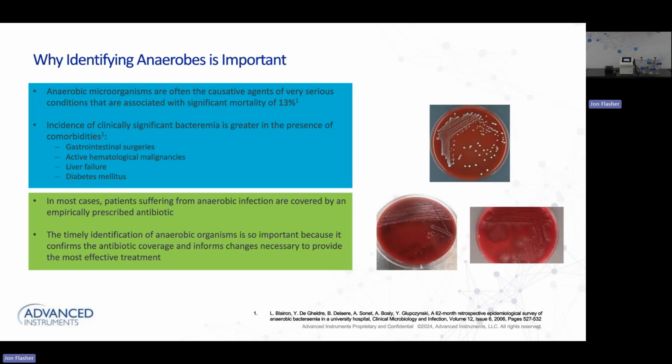And as most of us in the microbiology lab know, another important application of anaerobic culture is for orthopedic specimens. Your ortho surgeons might send down pieces of tissue from surgeries to make sure they didn't introduce any bacteria called Cutibacterium acnes, previously called Propionibacterium acnes. That's something we commonly check for, applying our anaerobic workflow to rule it out. In most cases, patients suffering from these infections are covered by empirically prescribed antibiotics, typically the drugs a physician might give a patient they suspect is suffering from some infectious agent. We'll cover these, but sometimes they're not.